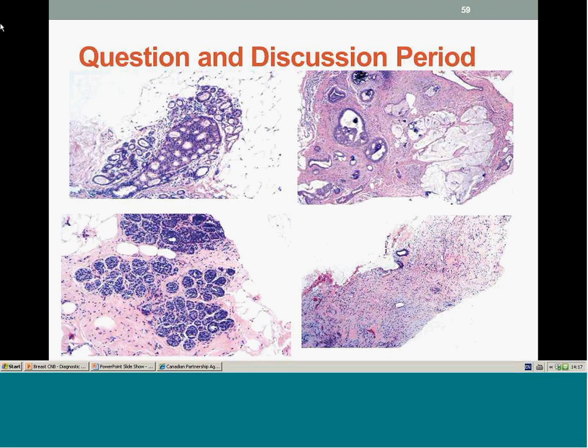You've got to make sure that it's the minimum 6 hours. So in the late afternoon, if you put it on a tissue processor and it doesn't get that 6 hours, then I think markers may be problematic, although in my opinion these are pretty robust markers. There too is something a bit tricky. In that setting, if you can't get that 1 hour cold ischemic time down, you may decide, well, maybe we're going to do it on the cores. The most important thing really is what's best for the patient, what's going to give the best quality result.